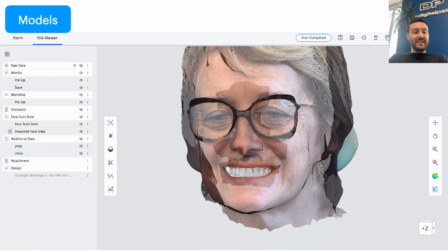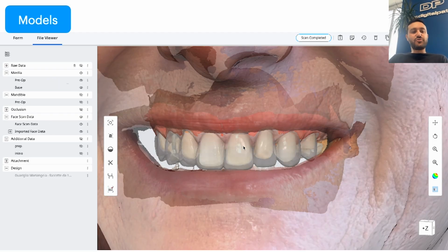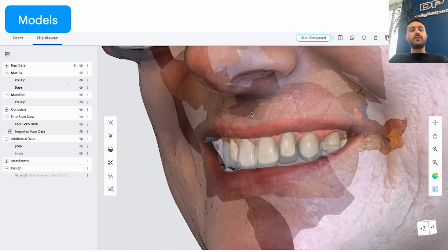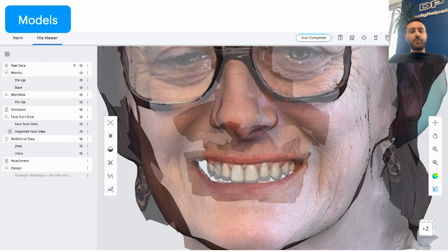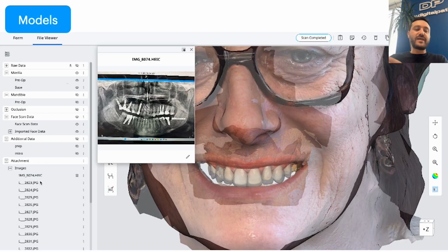And here we can see it clearly: the patient with the preps, the mockup design over the prep, and the 3D facial scan, all merged into a single unified model. This is the true power of the digital patient. It's not just about visual checks or estimating reduction.